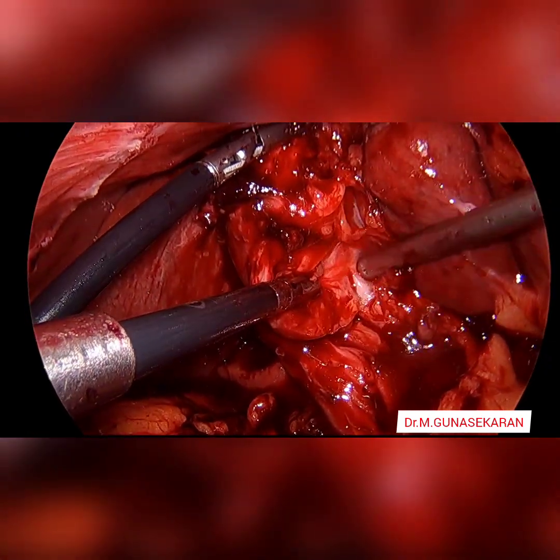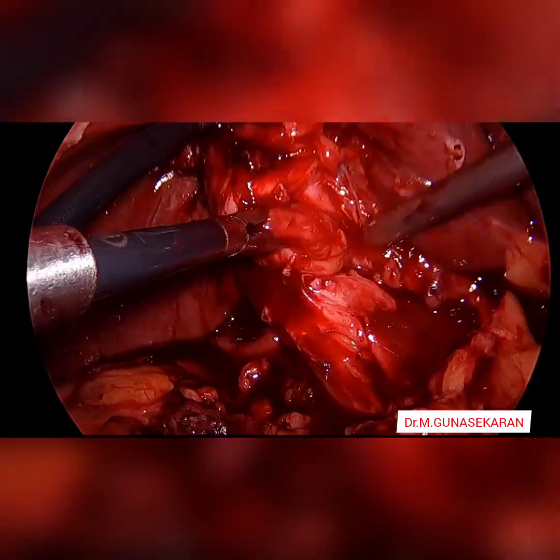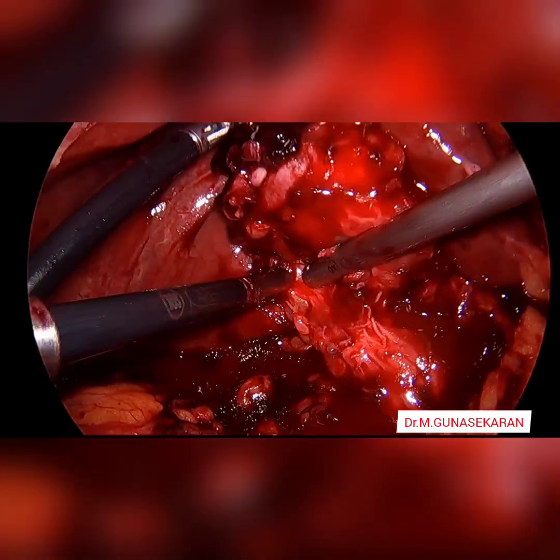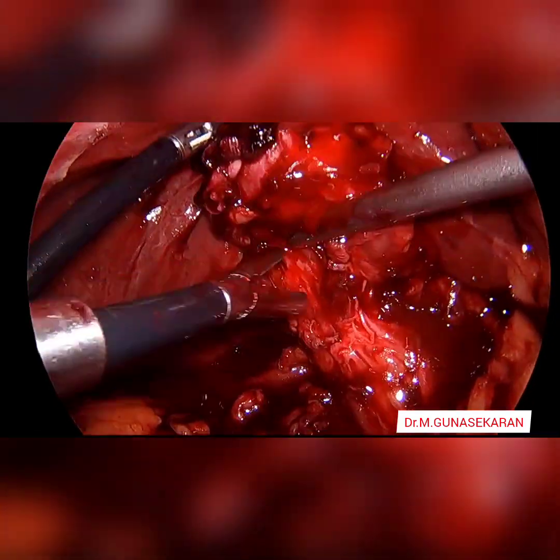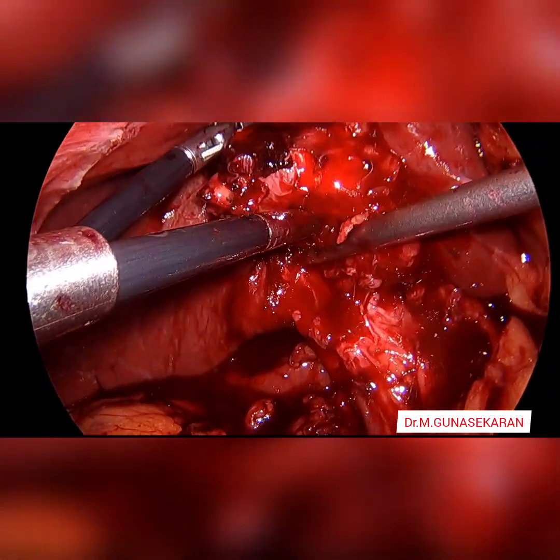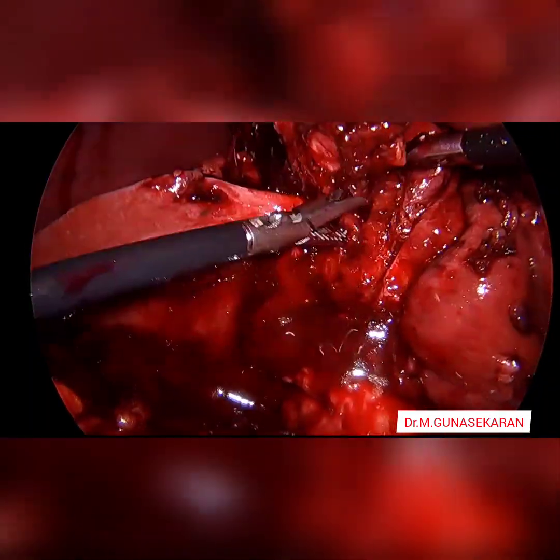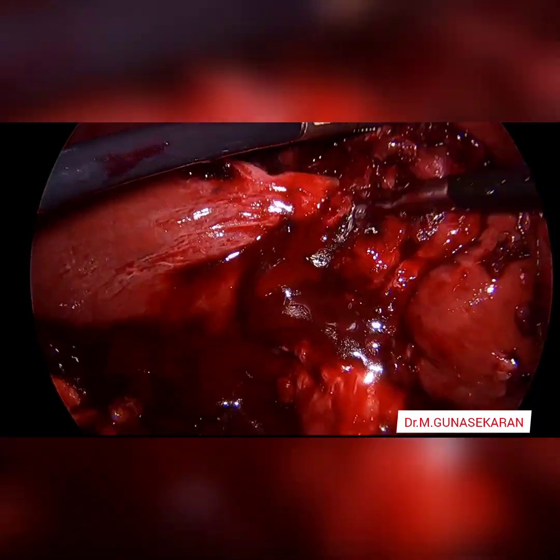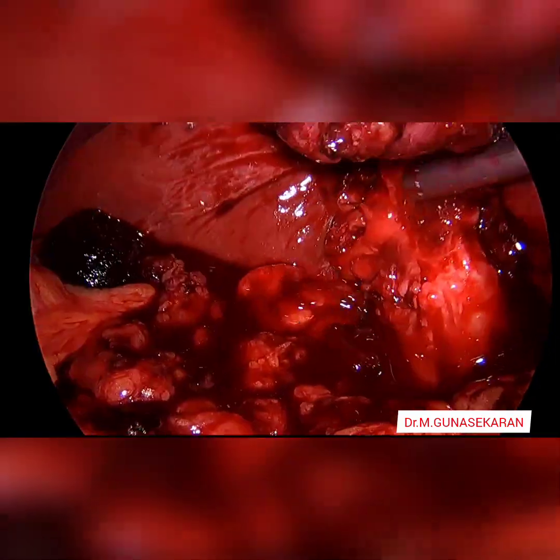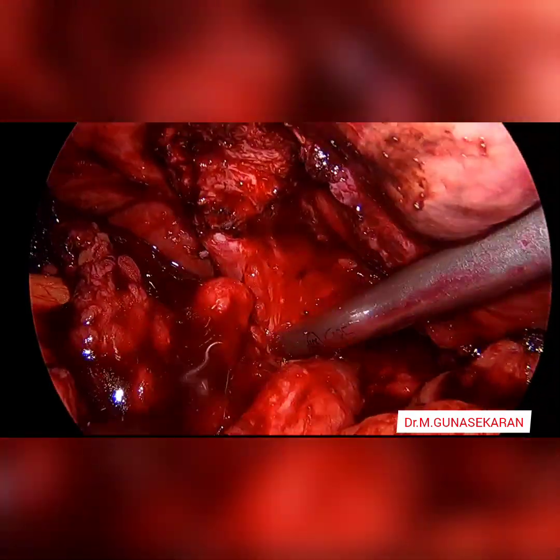Now I am proceeding towards the gallbladder fundus. The common bile duct is now completely free from the gallbladder. I am releasing the gallbladder from the liver bed. Now you can see a large stone — this is around 2 cm — and it has spilled into the peritoneal cavity.